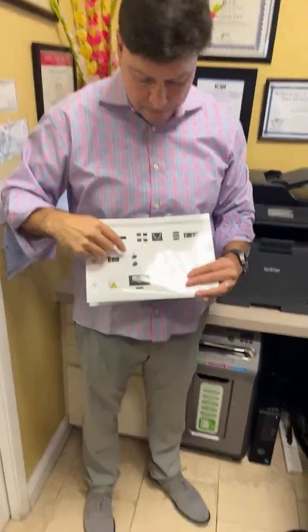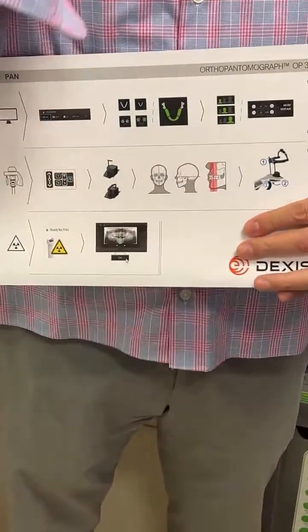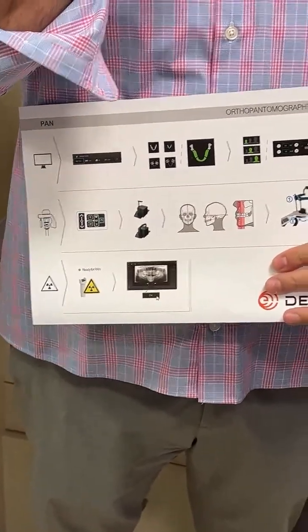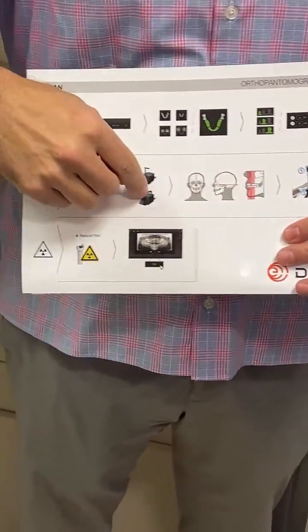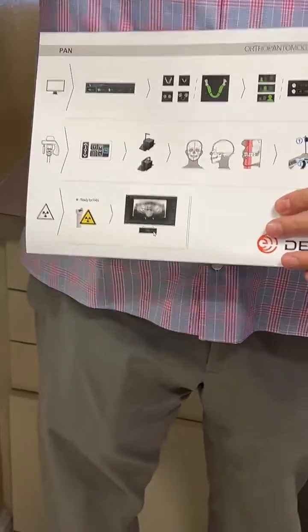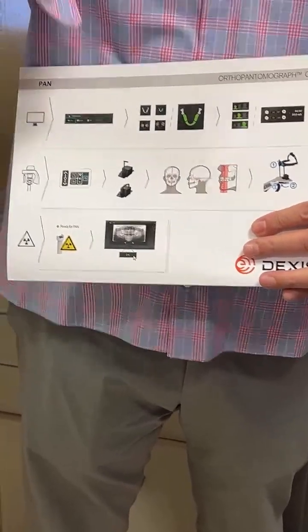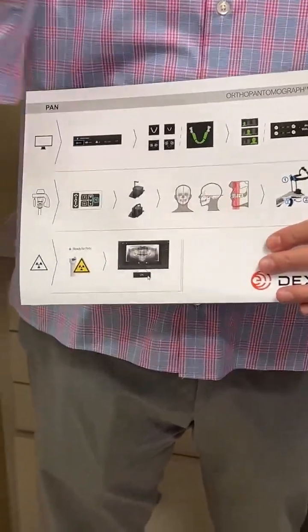Second thing is they don't want bone on bone when they're in the machine. You want a little separation. If you use the bite stick, you can do this too and put that in, but I would put a cotton roll so their gums aren't on hard plastic, to separate it. But I think the chin support is fine. Use that, separate upper and lower, and then positioning is all the same. Try to go off the nose, make sure they're not twisted.